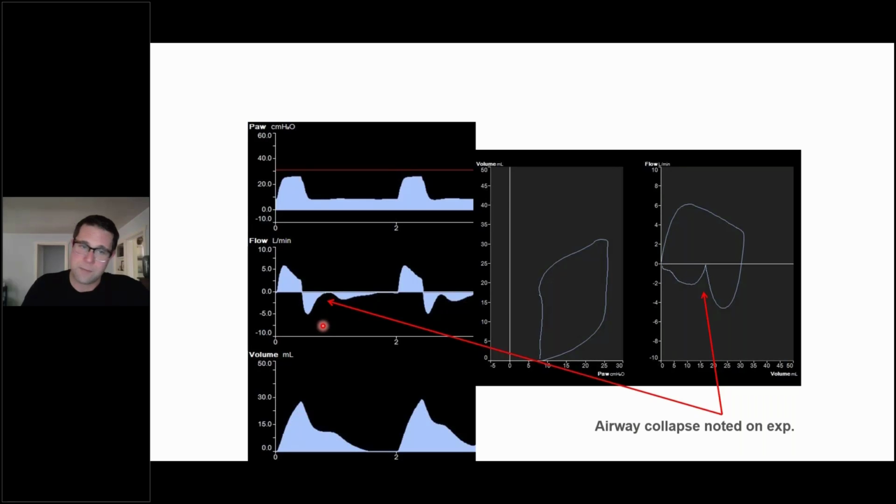And you can impress a whole lot of people if you can actually come in there and say, wow, I think something's going on. And by looking at these airway graphics and looking at the underlying asynchrony or poor patient ventilator interaction, you may be able to show the neonatologists and the folks at the bedside that it looks like there's a flow limitation. For some reason, the flow is going in. We should be using a slightly longer inspiratory time in this case, potentially. Flow's coming out, but then there's this choke point that's being created, and not all the flow comes out because it goes down to zero, and then maybe there's an active exhalation.